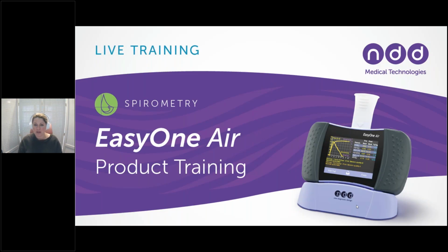Today, we are going to be talking about the EasyOne Air portable spirometer. If you happen to have a different NDD device, be sure to check back over on our website. We cycle through a different product every month to see when the next time the product that your facility owns will come available. But again, today we're going to talk about the Air and we're going to go ahead and get started.